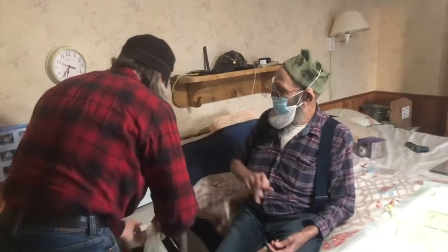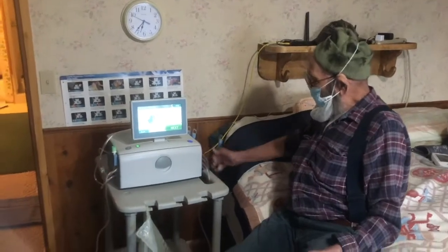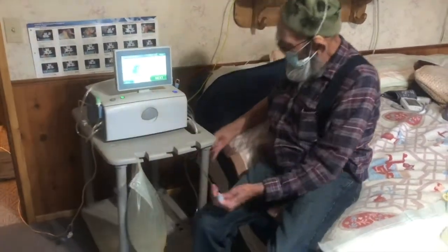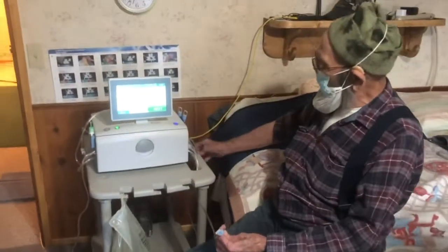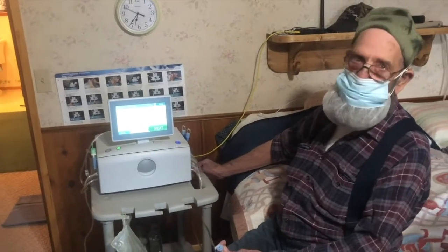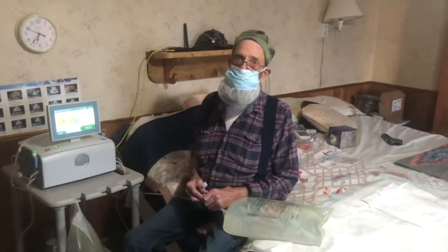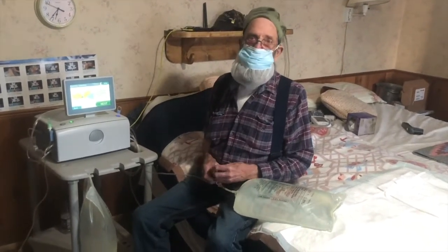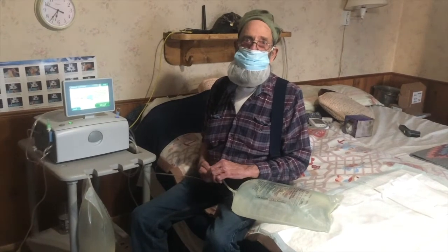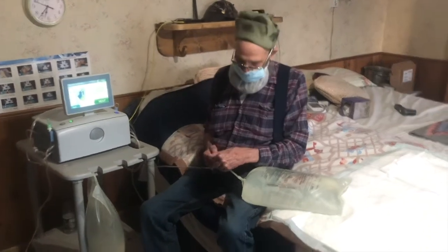Then remove a white clamp line from the organizer, then we take the white one and connect it to the first white prescribed solution bag on the organizer. You skip this blue one. This blue one, if you ever have to use all the other ones, is going to be your last line. And you can hang up to 4 bags on this machine. I only use 2 bags in mine, and mine is always the weakest solution, so I'm very fortunate there that everything works good on mine.